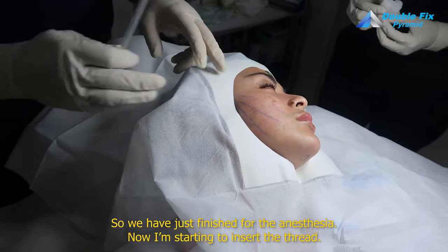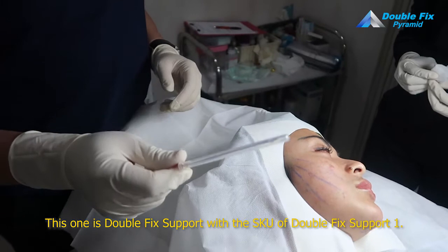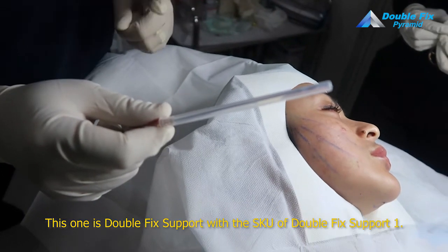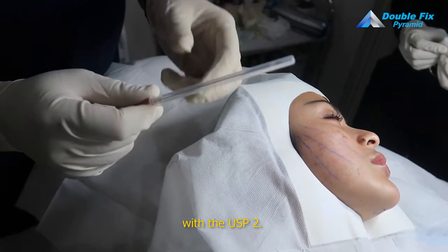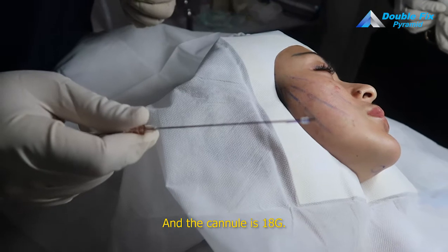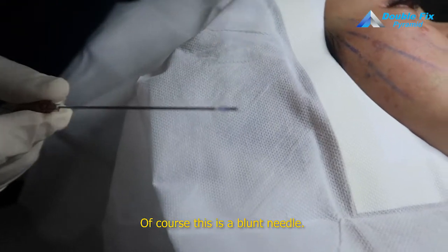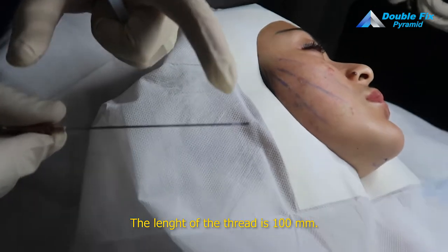Now I am starting to insert the thread. This one is Double Fix Support. The SKU is Double Fix Support One, so the USP is 2. The cannula is 18 gauge — you can see the cannula. Of course this is a blunt needle, and the length of the thread is 100mm.